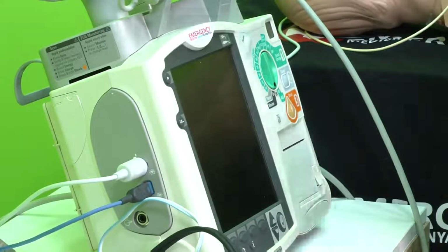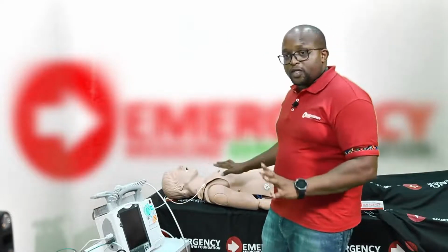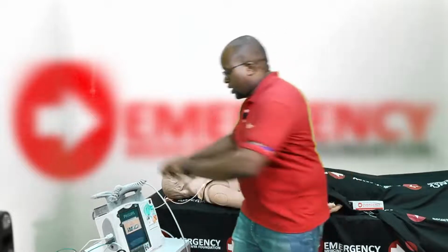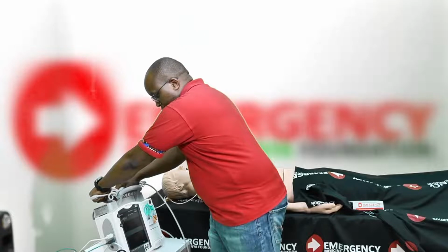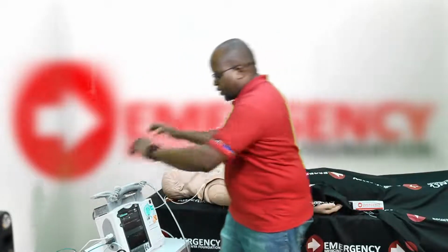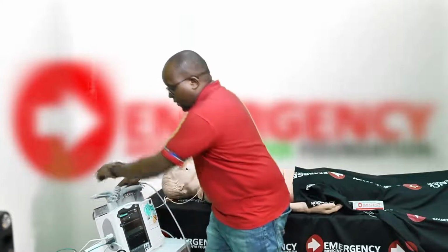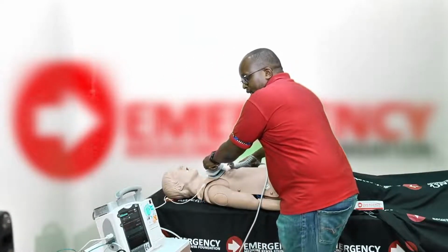Let's quickly go through a scenario where I need to defibrillate my patient. My patient has just arrived, and they're unresponsive. So I quickly want to check what's happening to the patient. I'll switch the monitor on. Okay, monitor is on. There's no pulse, of course, so someone is doing CPR. I'll quickly make sure I'm on paddles. I'll take my paddles and check the rhythm. From the monitor, I can see my patient is in ventricular fibrillation.